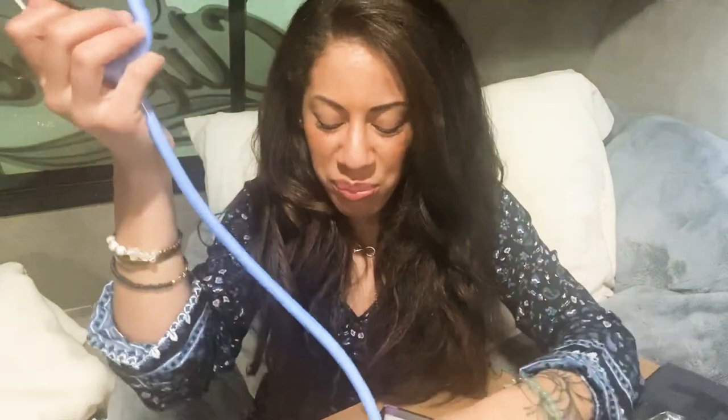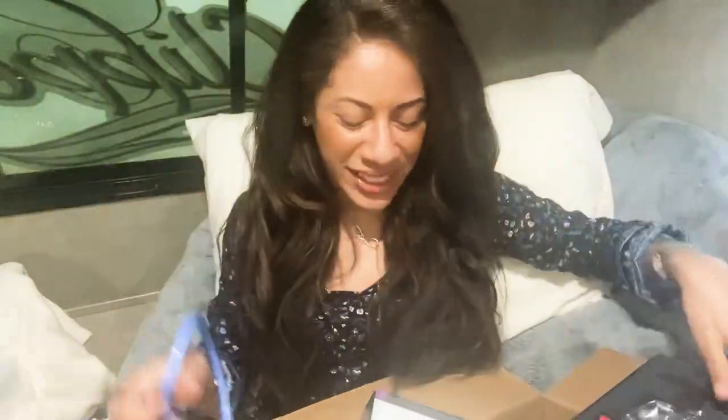Also, fun fact, when you put these in your ears, you don't put them in the way that you think they would go. To me, it looks like you would put them in facing towards you. You do it facing out. I hope that's correct. If I'm wrong, correct me. But I believe it's facing out. But that's my stethoscope. It's so pretty.